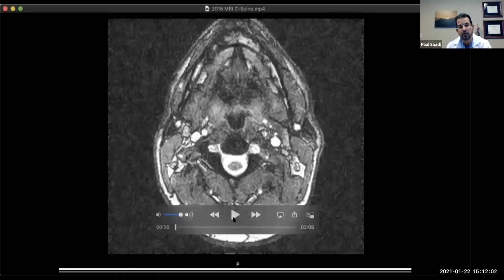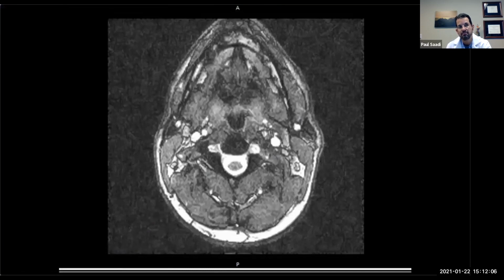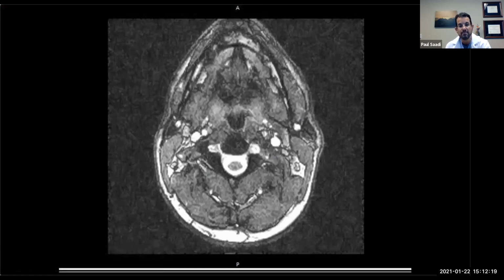Yeah, if I could stop you right there. So that's a really good picture. And that's an average to possibly larger than average normal sized tunnel. So I can't measure it because it's on a screen and it's magnified. So I don't know what my referencing ruler would be, but based on the surrounding structures, if we look at that little... I'm not sure if you can point to the spinal cord.